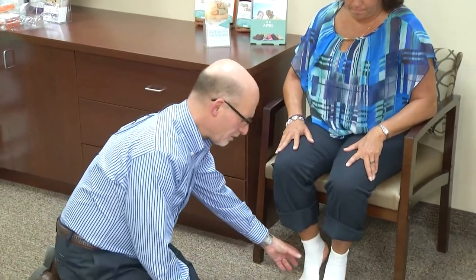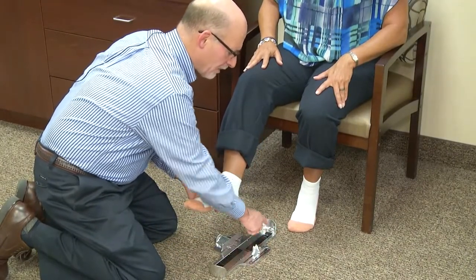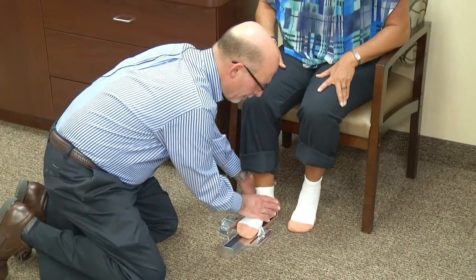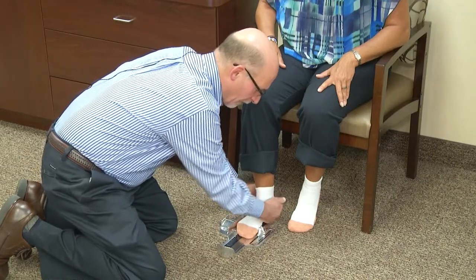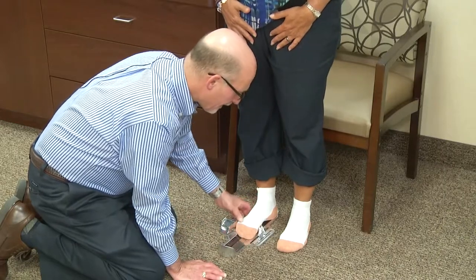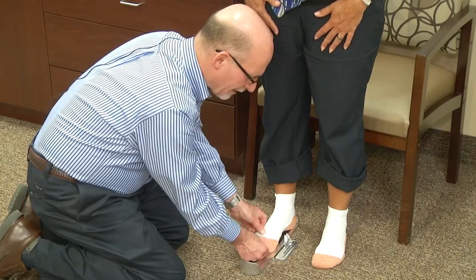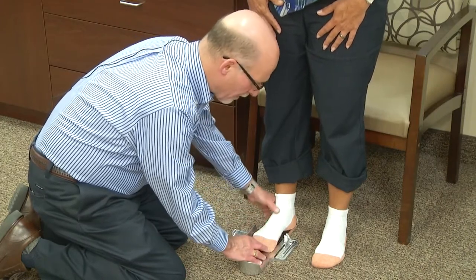I will now demonstrate how to properly use a Brannock device. I'm going to place Karen's right foot onto the Brannock device into the heel cup marked right heel. I'm going to make sure that her heel is not pressed too hard back into the device — it is just resting, cupped by the device. I'm going to ask her to stand. You always want to have an even distribution of weight on both feet when you measure in the standing position. You want to make sure the socks are not pulled too tight, which may cause the toes to go into flexion, and you don't want them too loose, which will give you a longer measurement.